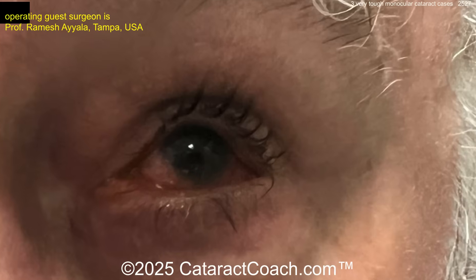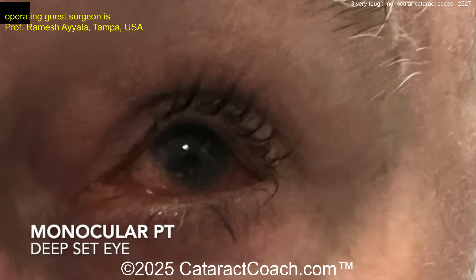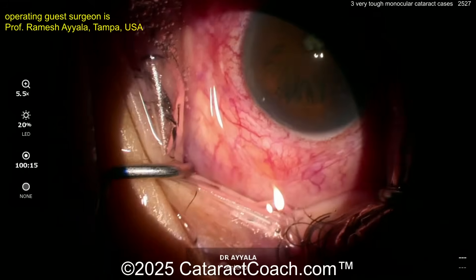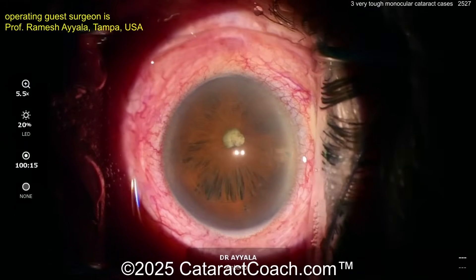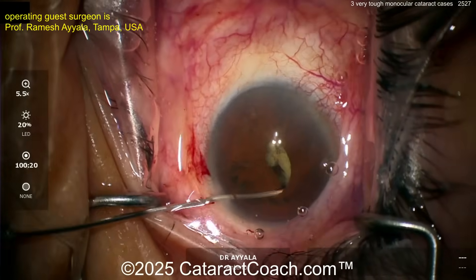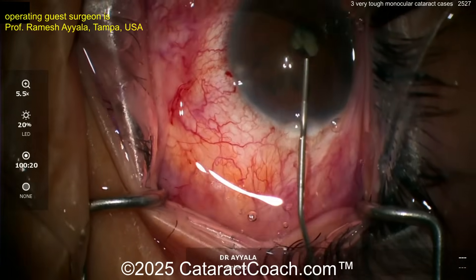14.5 millimeter nanophthalmic monocular patient. Look at that deep-set eye — 14.5 millimeters. Look at the irregular-looking iris and the tiny pupil. This is just stressful looking at it. So there's the paracentesis — trying to break some synechiae that are there.